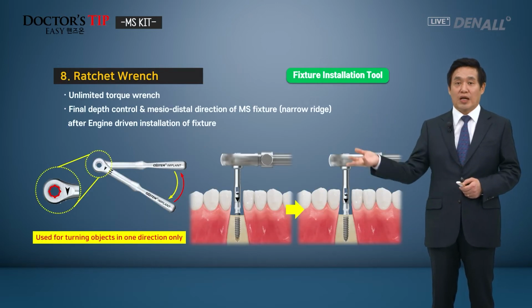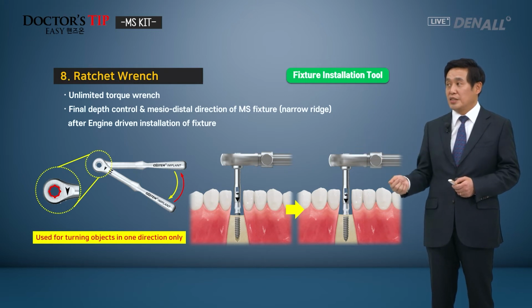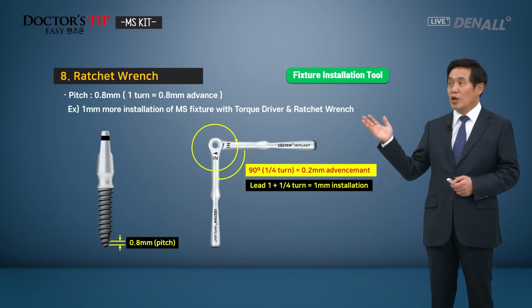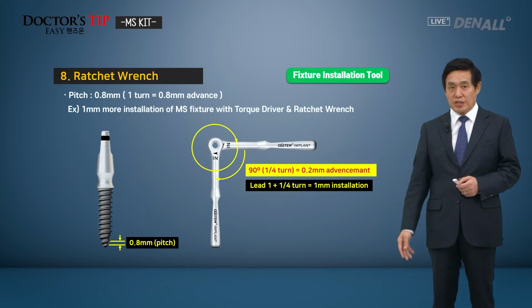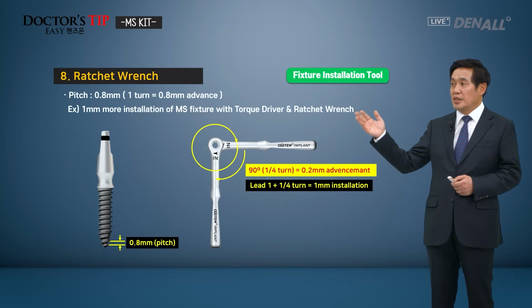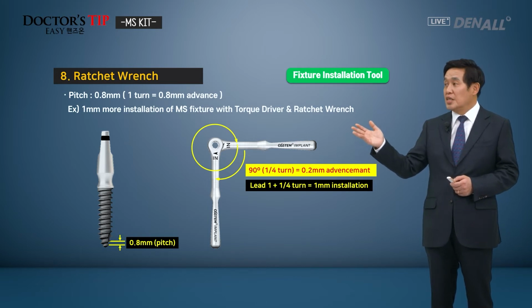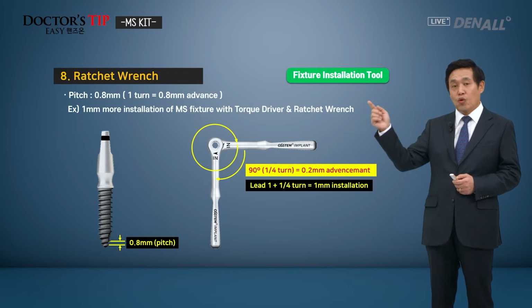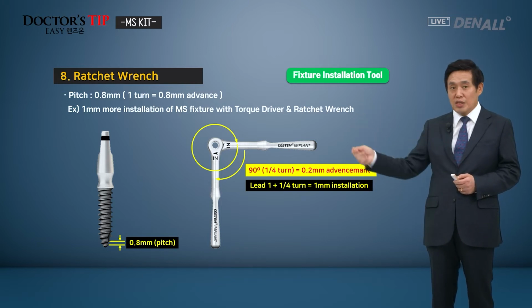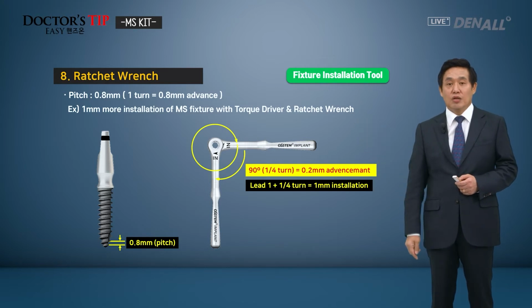Next is the ratchet wrench. This is a very basic tool that you would know, a one-directional ratchet wrench, and you can use it as a hand wrench. And one more thing I want to tell you is that in the case of mandibular anterior, for the MS implant, the pitch is 0.8. This means that with the hand wrench, if you do one turn, about 0.8 implant advancement happens. So in case of one quarter turn, 0.2 millimeter advancement. So if you want to advance 1 millimeter, one turn plus 90 degrees in addition. So depending on a 90 degree turn, how much advancement is made? 0.2. You have to be mindful of that to adjust your depth.